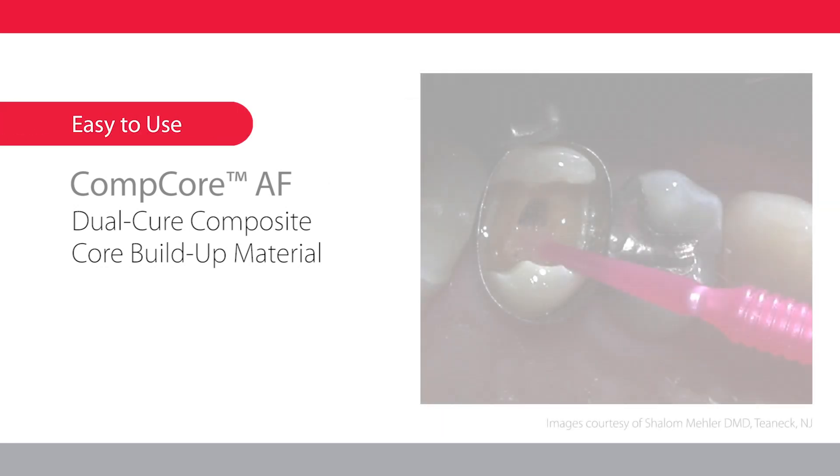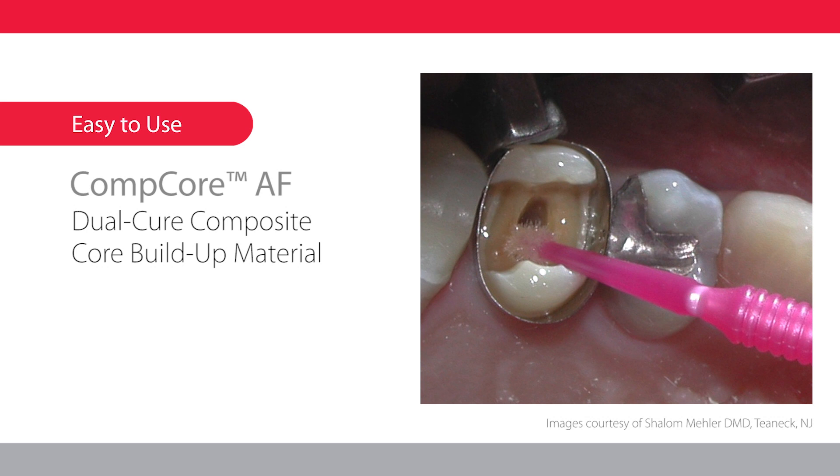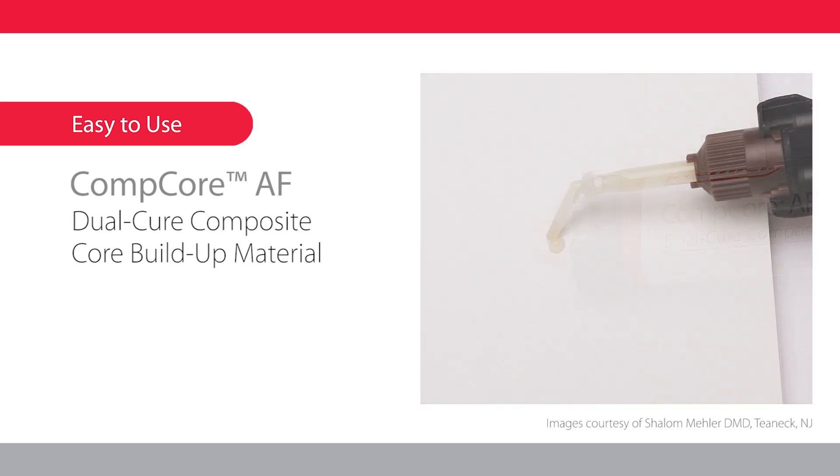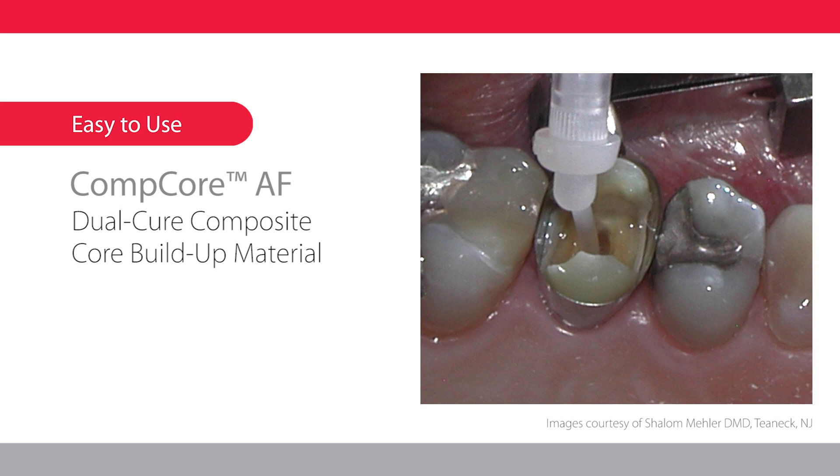After preparing the tooth and applying an adhesive system that is compatible with chemical and dual cure composites, bleed the Comcore AF syringe, assemble intraoral tip to mix tip, attach to syringe, and bleed again. Next, place the intraoral tip into the base of the prepared tooth and dispense. Allow the resin to rise around the tip while withdrawing to eliminate air bubbles.